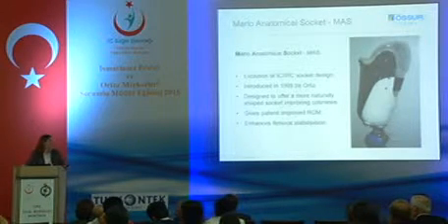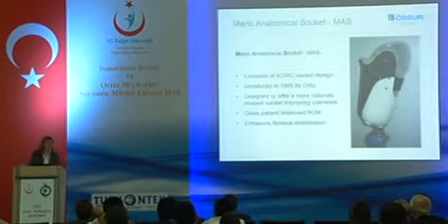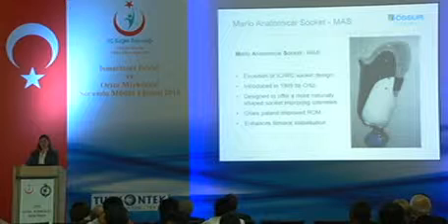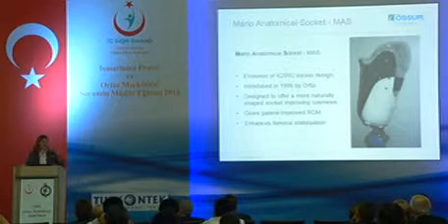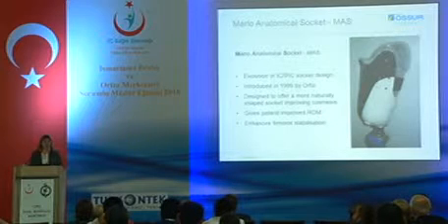Because of this, the amputee started to be able to have much more range of motion, so be able to bend over without the socket digging in, stretch, do sports, sit cross-legged, so in lots of different positions.